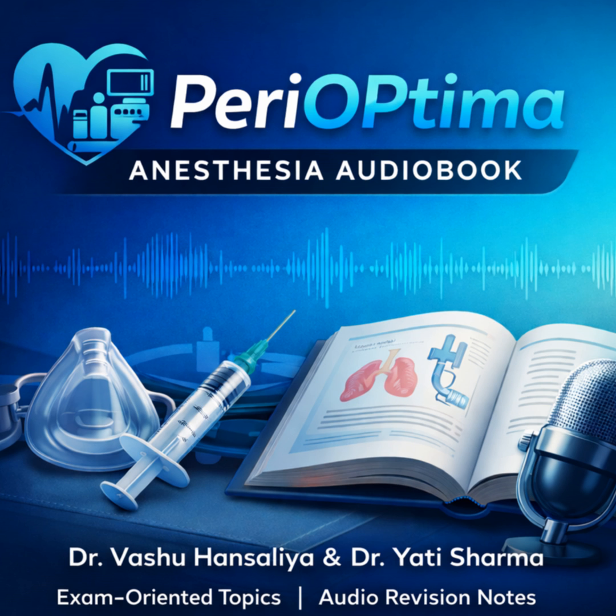3. The classic LMA is limited by a 20 cm H2O seal pressure and lacks aspiration protection features. 4. Second-generation devices achieve high seal pressures. ProSeal 30 cm H2O, Supreme 37 cm H2O, and include the critical gastric drainage channel to mitigate aspiration risk. 5. SGADs are pivotal in the DAA, serving as the required rescue oxygenation device in the CICO sequence. 6. SGADs are a relative contraindication if consistent peak inspiratory pressures exceed 30 cm H2O. 7. Insertion must occur during adequate suppression of laryngeal reflexes, which often requires propofol but not necessarily muscle relaxants.